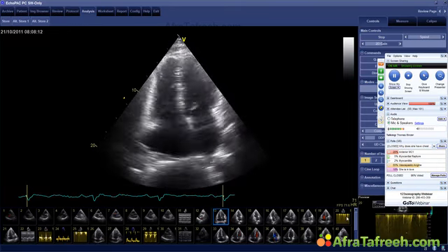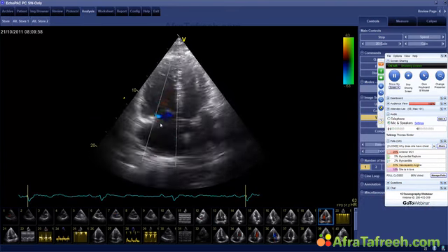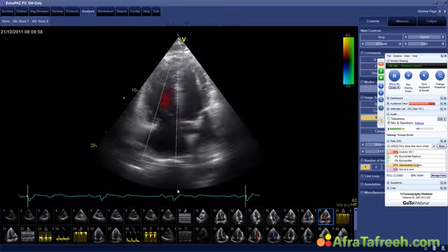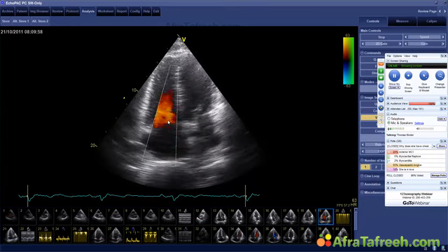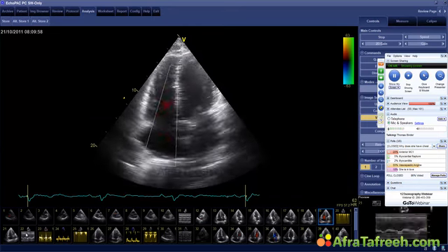Now, you probably want to know if the patient has tricuspid regurgitation. He does, a very weak signal. So maybe something that you should also try to do when you try to get the tricuspid regurgitant signal: use a small sector. Try to keep it as narrow as possible. It doesn't make a big difference if it's long or not, but it should not be very wide, because that way you have a much better sensitivity and frame rate for detecting tricuspid regurgitation. And then stick with the color as long as the patient breathes, because sometimes you might catch the TR better if the patient inspirates or inhales.